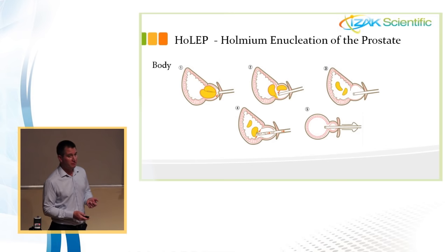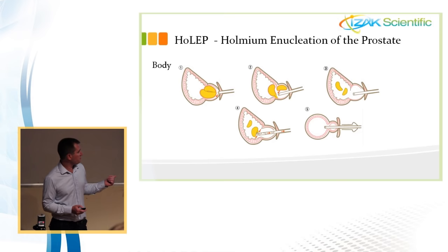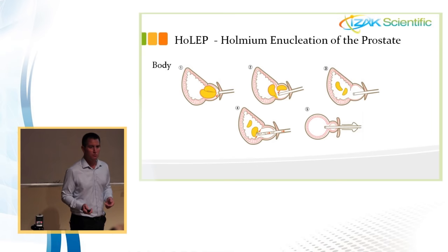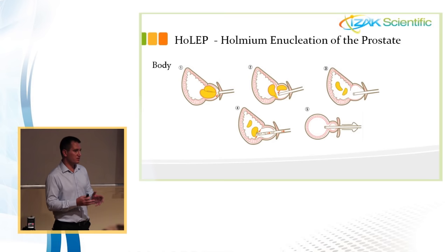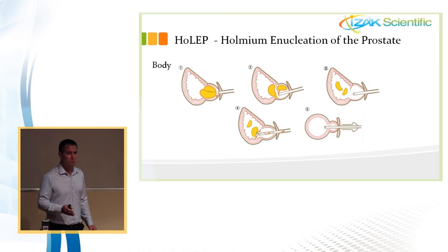The main advantage of this method is that there is no prostate left after it, so the prostate does not increase. In the previous solutions, like green light laser or Holmium ablation of the prostate, the prostate still increases after a few years, and people need to do this procedure again after 5-10 years. It's one of the interests of the surgeon. It depends, of course, on who, but there is a lot. There is another consideration, the commercialization consideration of the surgeon as well.